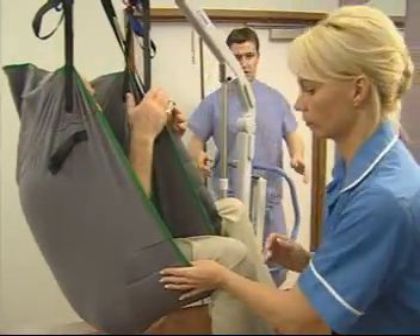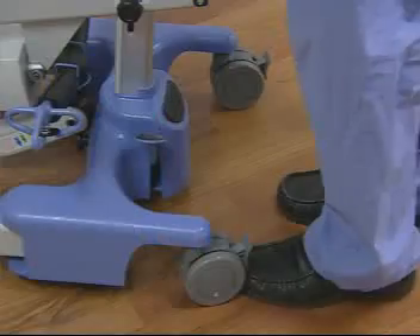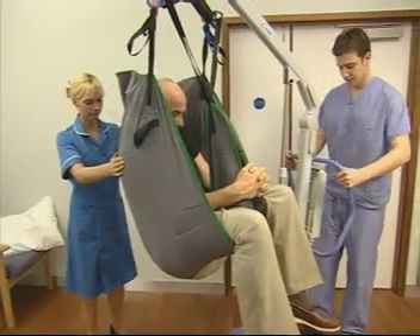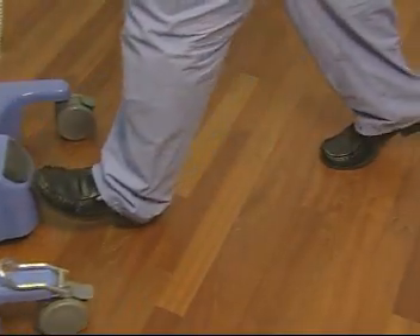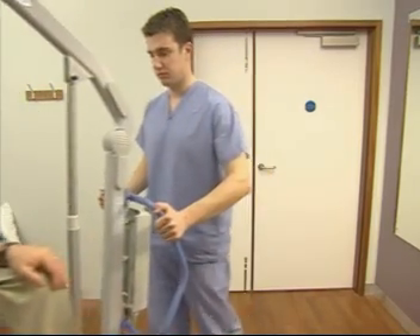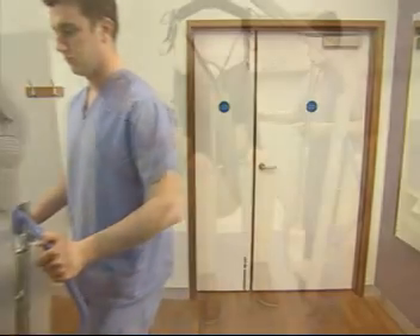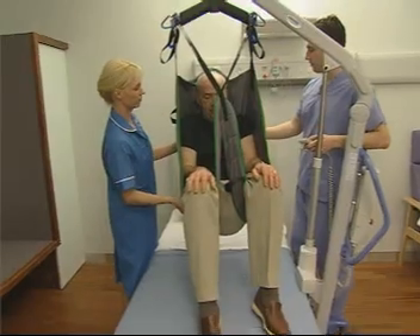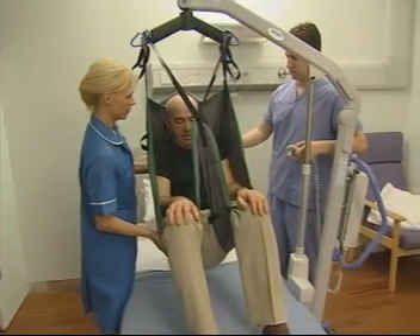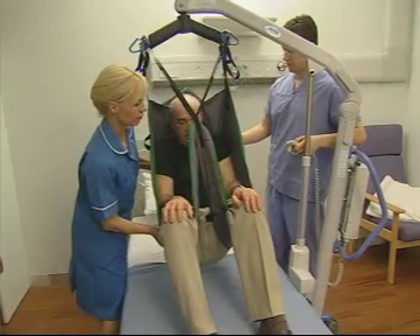When ready, move to the back of the lift and remove the brakes. Use the push pad to initiate forward movement. Hold the lift at a comfortable height and keep square to the load as you move. Once in position above the bed, gently lower the patient, reassuring and supporting them as necessary.